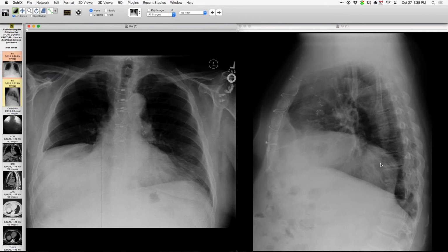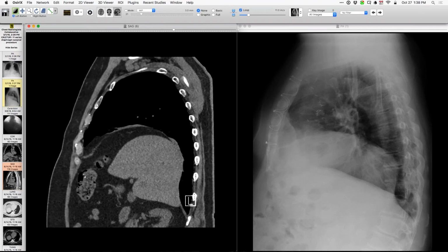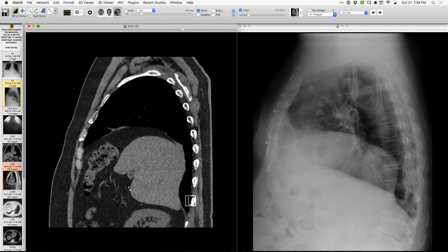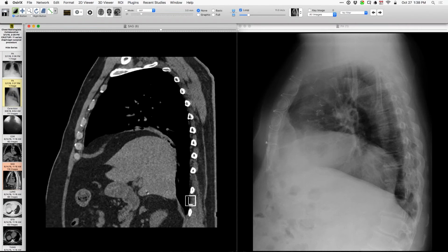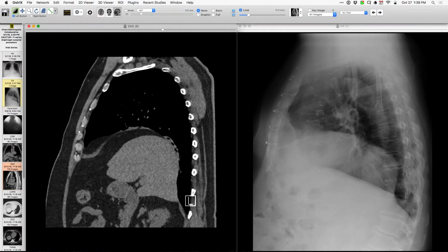And when I see this, I suggest eventration rather than paralysis, particularly when the diaphragm doesn't go all the way up posteriorly. So let me bring alongside the sagittal CT. And if we go over there and look at the diaphragm, we can see where it's really thinned in its central portion corresponding to the elevated portion. Notice posteriorly here that we do have some diaphragm muscle. And what I couldn't tell is that there's actually some anteriorly as well. So a good portion, but not all of the diaphragm, is elevated, except for here and there.